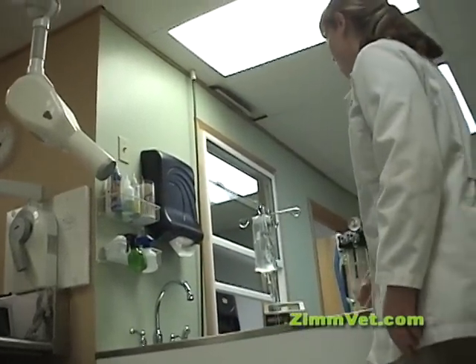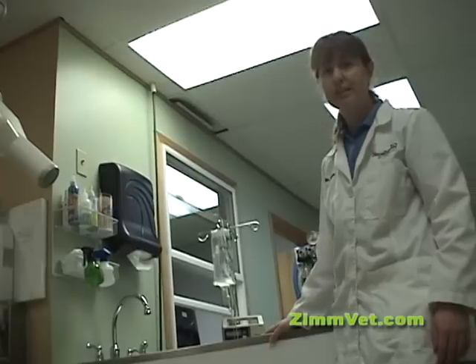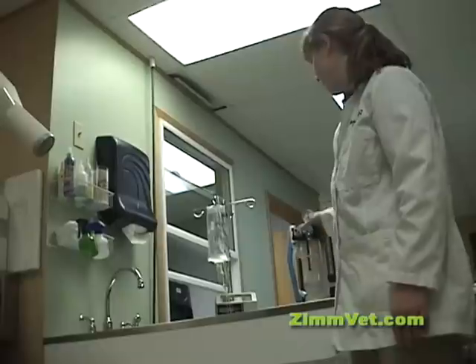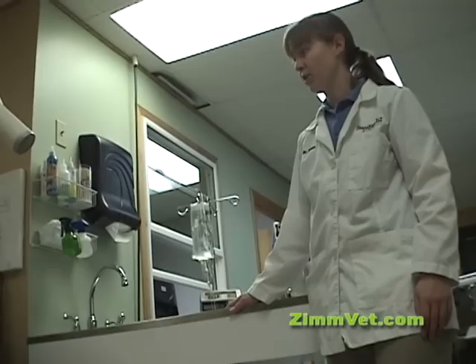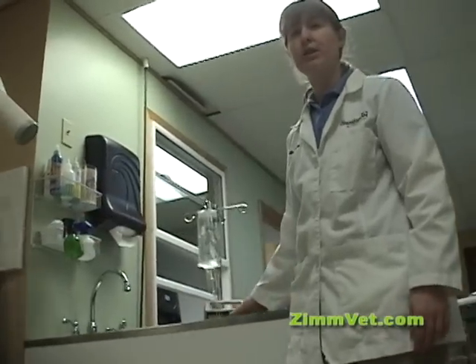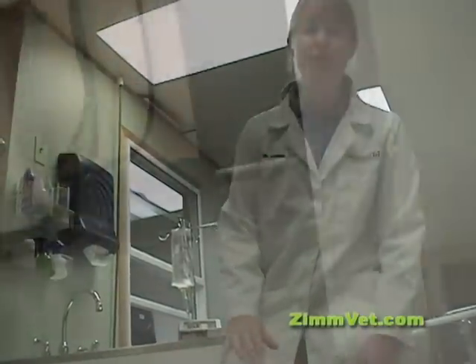During surgery, we also give you IV fluids to make sure that your blood pressure stays at a good level and also that you stay hydrated. We have our anesthesia machines to make sure that you're comfortable and safe during the entire procedure, that we can fully evaluate your mouth. Then we also have monitoring that we can monitor blood pressure, ECG, heart rate, make sure that you're staying nice and healthy during the entire procedure. Dental care is really important for your health. Flossie.